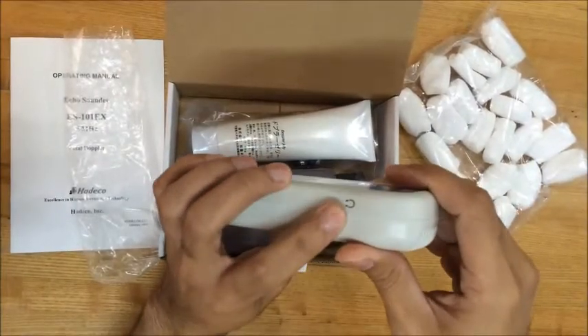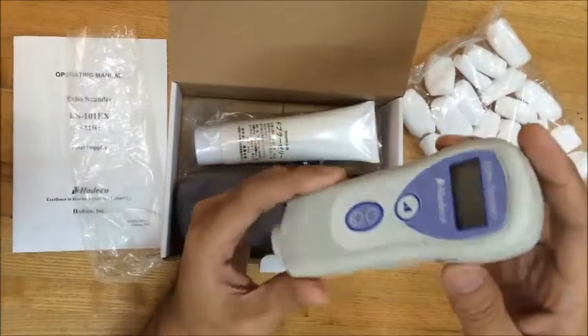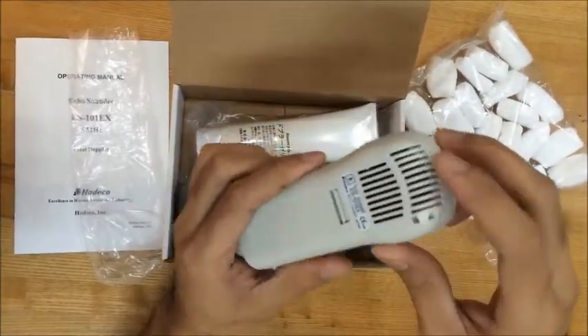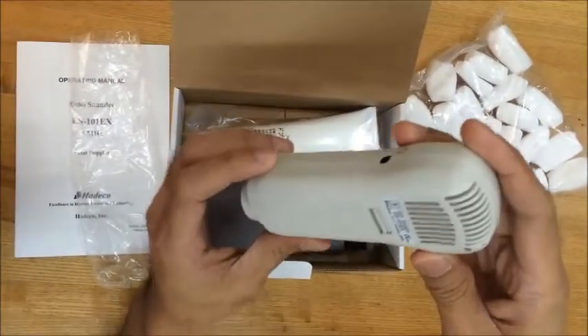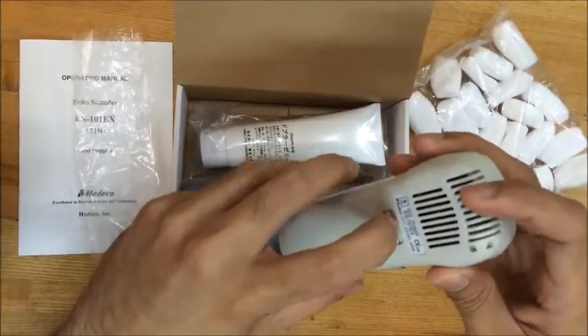Here at the side you can see is the headset connector to connect the headset. And at the back here is the speaker. The speaker of course is to hear the Doppler sounds. And here is the headphones. And here is the battery cover.